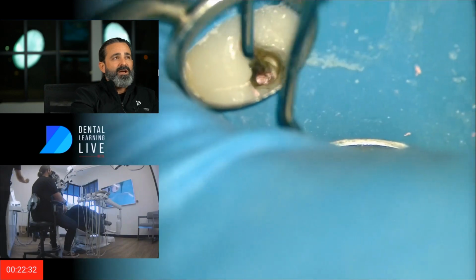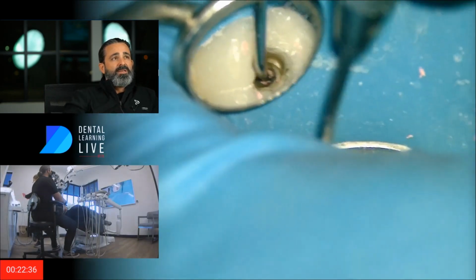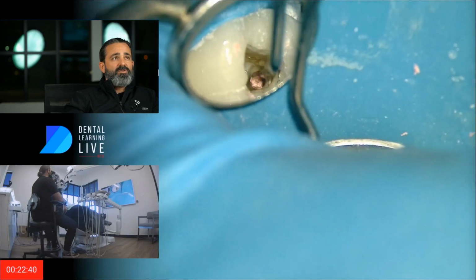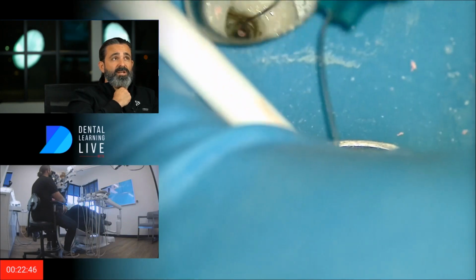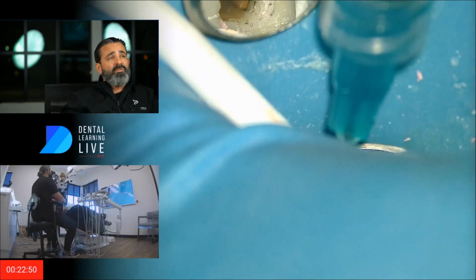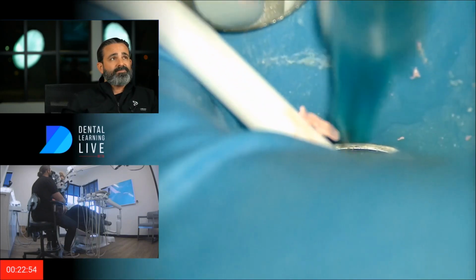But what I'm doing now is it's pretty stuck on the file, and maybe it was the technique that I was employing. But I knew that it was loose enough where I could get an Explorer and just start clawing at it and just wicking it off the wall. Once I created that separation from the wall and gutta percha, I went back to solvent and I just danced with it again.